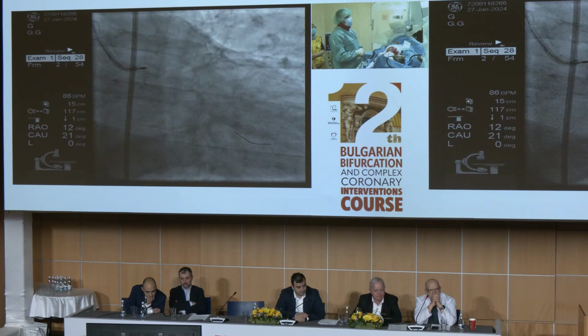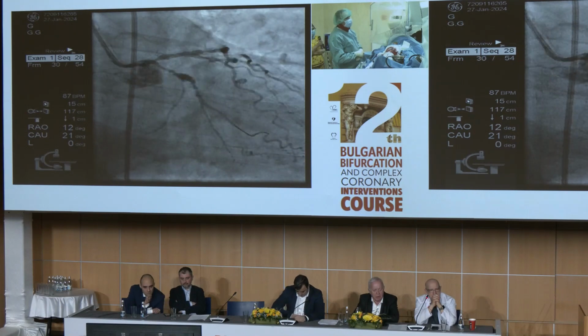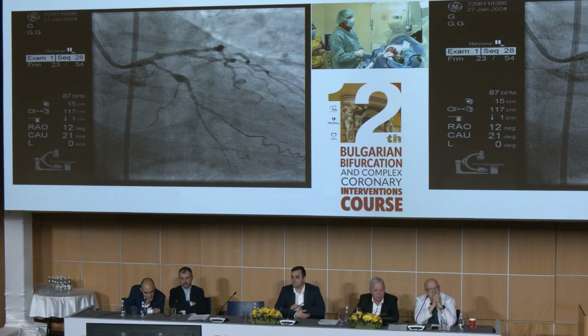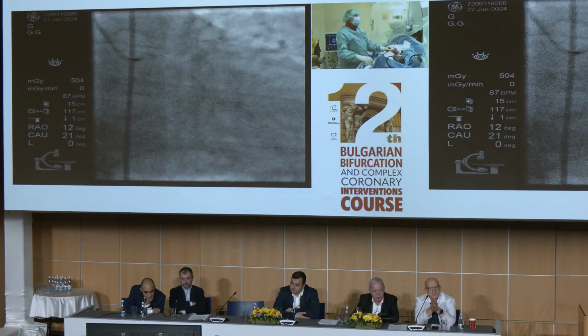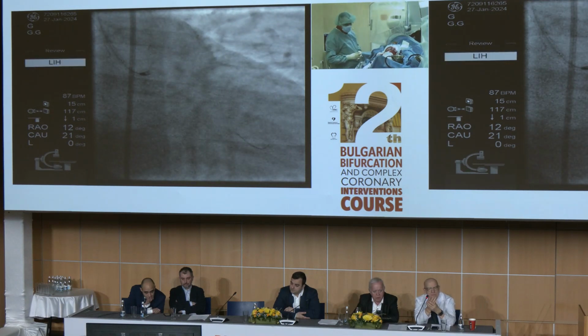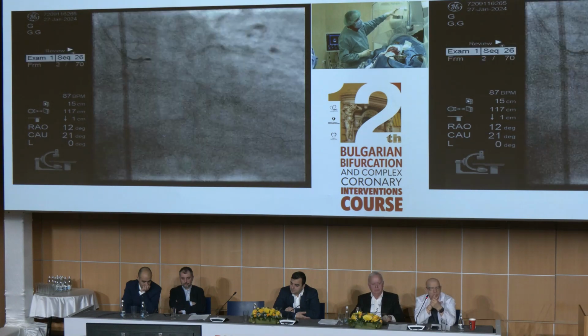So your suggestion is to do only circumflex? No, I mean, to fix the lesions and then switch to the LAD. What I would do is just finish the CIRC, exchange the wire or whatever you prefer, predilate with a non-compliant balloon and just stent it. And after that, go to the LAD. Or depending, we can postpone the LAD for another session.